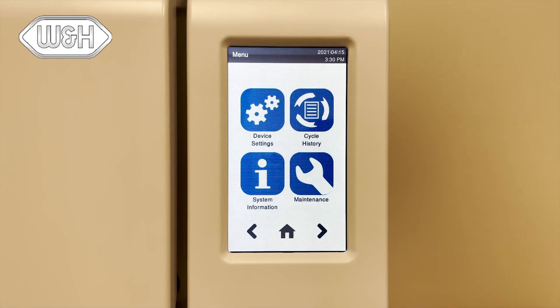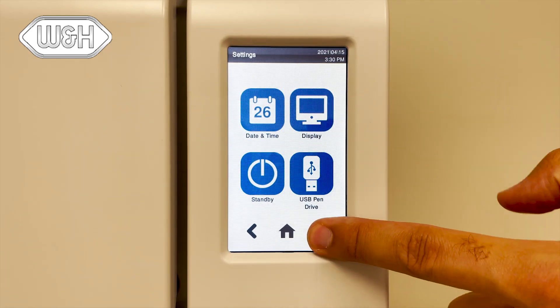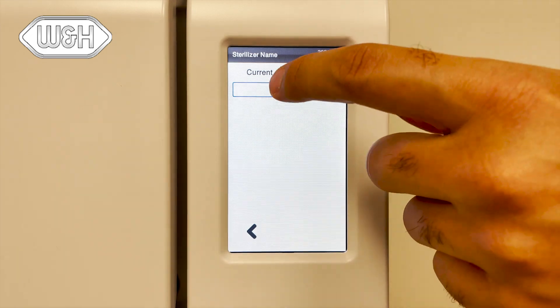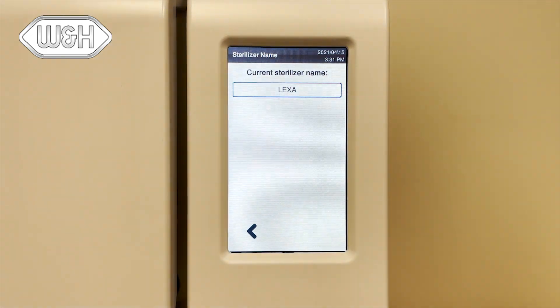To set the name of the unit, from the device settings menu, press the right arrow, press sterilizer name, and assign your sterilizer a name. Once completed, this name will be used in all sterilizer cycle reports stored in the USB drive located behind the service door in the front of the Lexa.